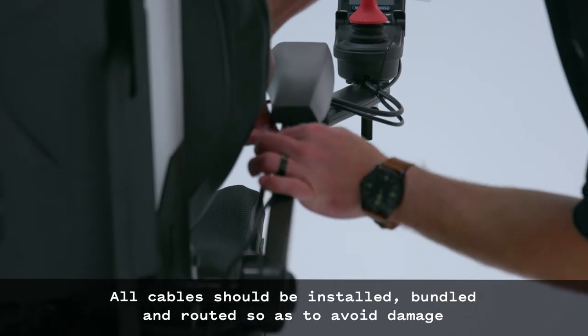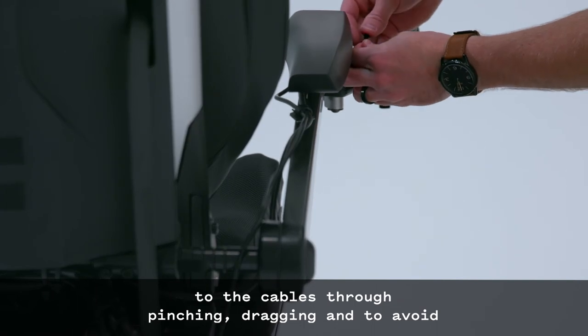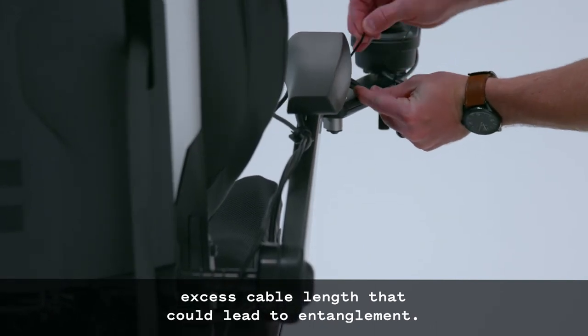All cables should be installed, bundled, and routed so as to avoid damage to the cables through pinching, dragging, and to avoid excess cable length that could lead to entanglement.